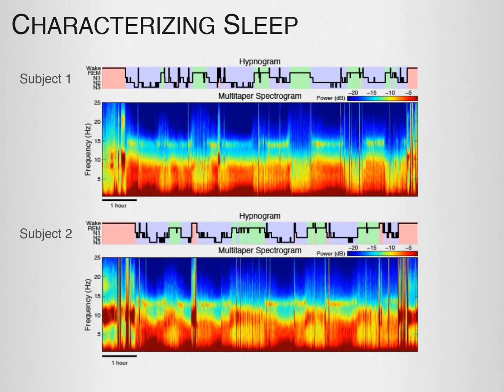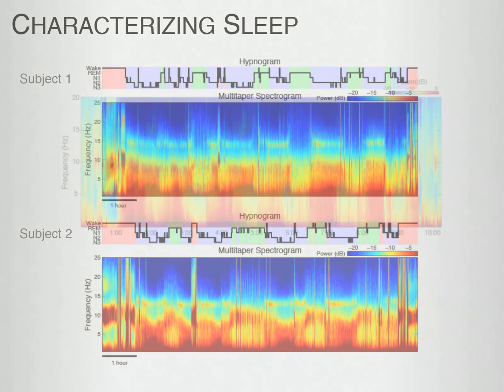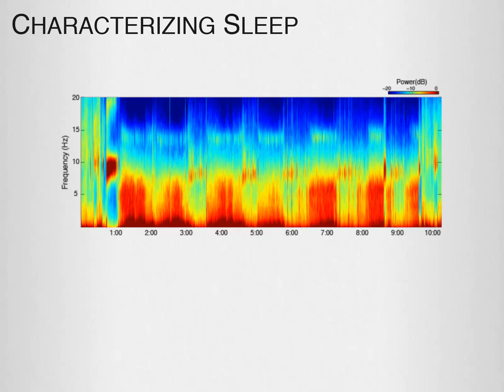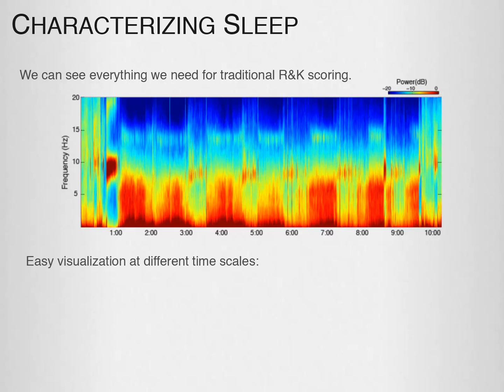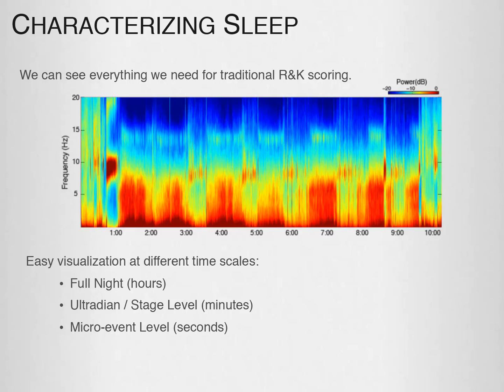Here are a couple of hypnograms and spectrograms from two different test subjects. You can observe that while there is some heterogeneity between them, overall you can see common repeating patterns that align with the traditional sleep scores of wake, REM, and non-REM sleep. With these multi-taper spectrograms, we can see everything we need for traditional RNK scoring, and they provide a means for easy visualization at different time scales — whether a full night on the scale of hours, ultradian or stage level on the scale of minutes, or microevent level on the scale of seconds.